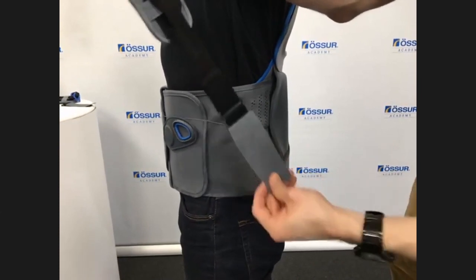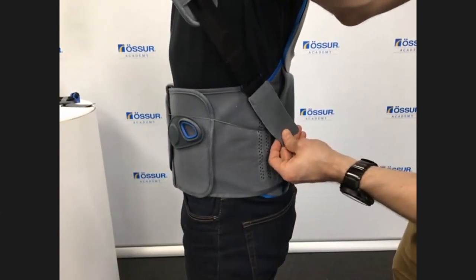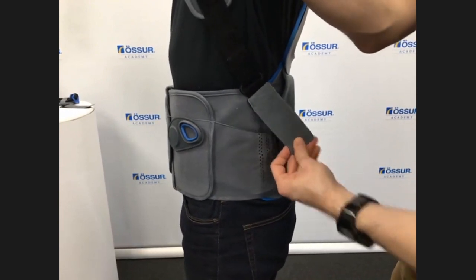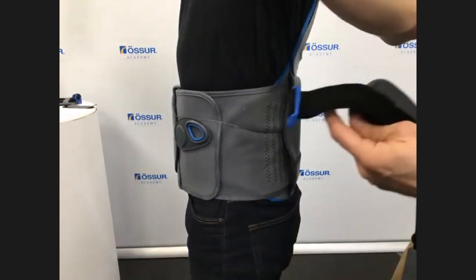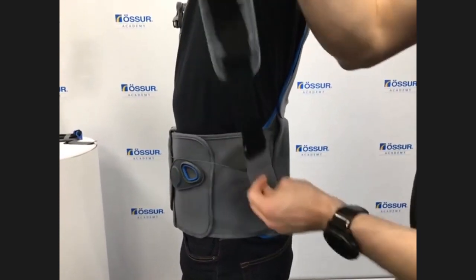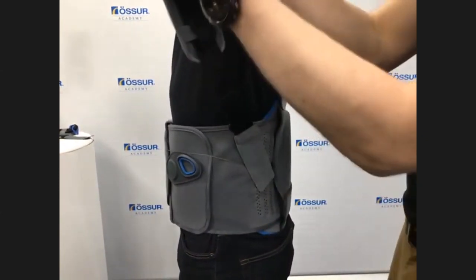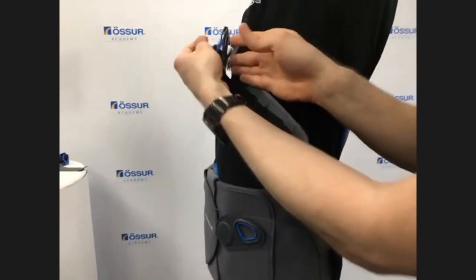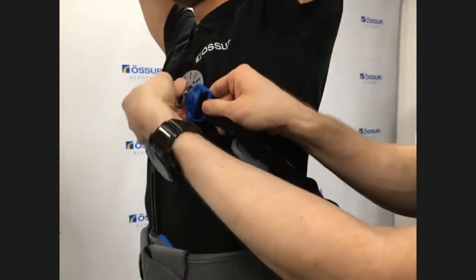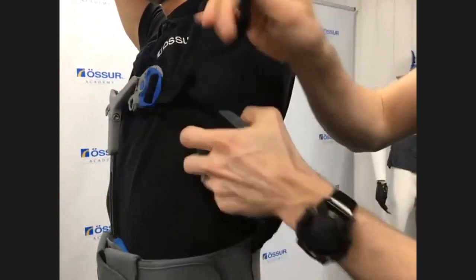So these can be attached wherever we would like on this posterior section. We can also change the angulation. So if, for example, we're wanting to make sure we're avoiding the bust, we can adjust this to wherever we would need. These should also go underneath the traction cords, for the compression cords for tightening those. And this just clicks into, there should just be a single one of these, but I'll show you that extra one later. And then we're just tightening these either side.